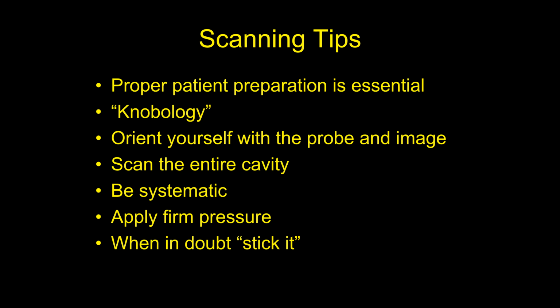The other thing I would tell you is don't be wussy when you do your ultrasound. You need to apply enough pressure on the abdomen to where you can get a good image. So you don't just barely touch the probe to the abdominal wall. You tend to push down pretty darn hard into the abdomen, and that allows you to move gas-filled bowel loops out of the way. It puts your probe closer to the organ that you're trying to see, which makes the picture better. So don't be afraid to push down pretty hard on the animal's abdominal wall.